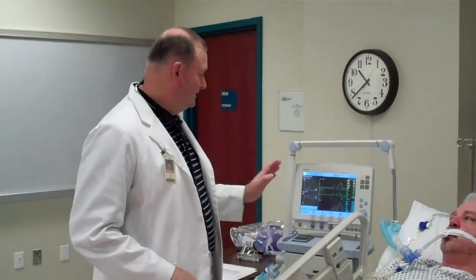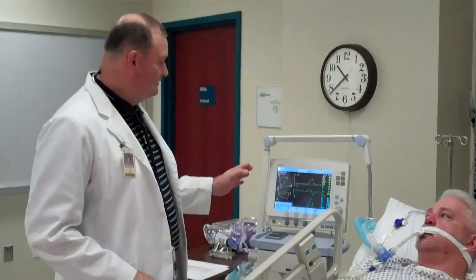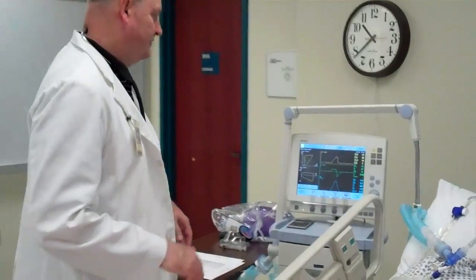This is part four: patient ventilator assessment. In the last part, part three, we demonstrated how to set a pause pressure and check plateau pressure. Now I'm going to show you another way that you can get the plateau pressure without setting the pause pressure.